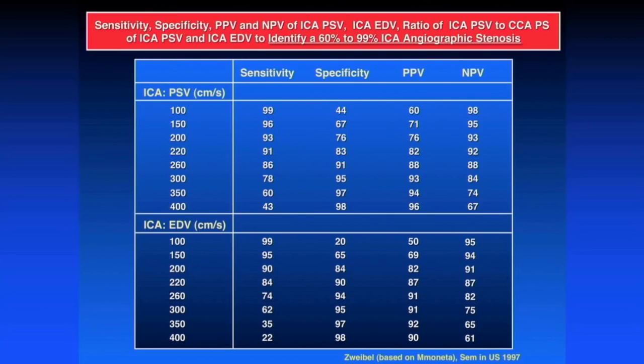In the past, we would do ultrasound as the absolute first screening test, and patients would then have a follow-up test, whether it was an angiogram, in some cases CTA, and you may still be doing it in your institution. If you're doing that, you want a high sensitivity test and low specificity, right? Because you want to make sure that you don't miss the disease.